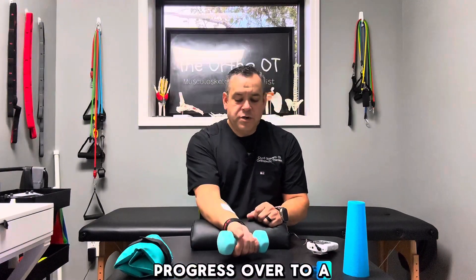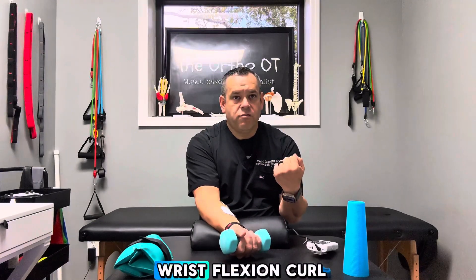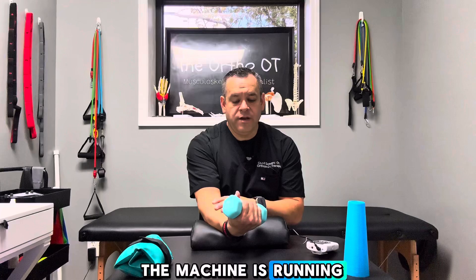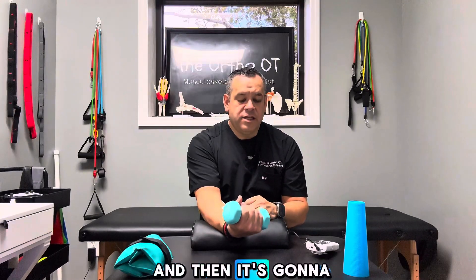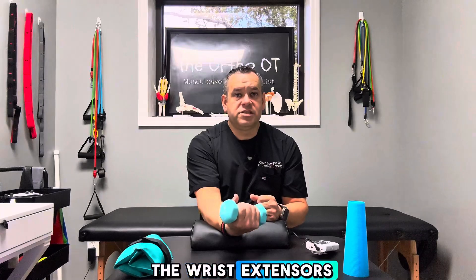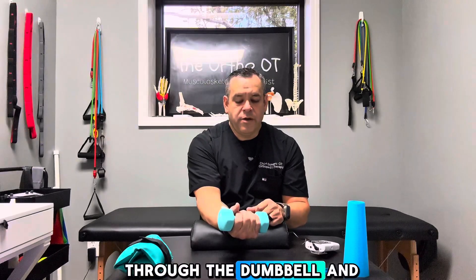We're going to progress over to a dumbbell — hold a light dumbbell. When it kicks on, we're going to curl up the dumbbell in a wrist flexion curl. We're going to hold that the whole time the machine is running and then relax when it kicks back off. I have this set to kick on and off pretty fast — on for five seconds, off for five seconds. In a normal situation I would have it off for a longer period to give the patient a break and time for tissue to recover. This could also be placed on the wrist extensors — if on the backside, you could go into wrist extension or deviation. I'd have them do the dumbbell portion for maybe 10 to 15 minutes.